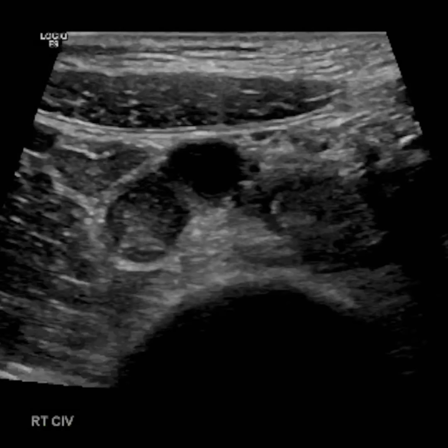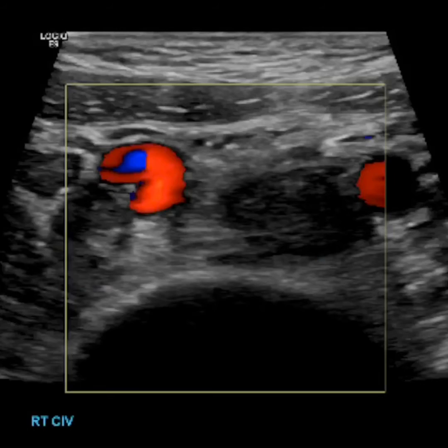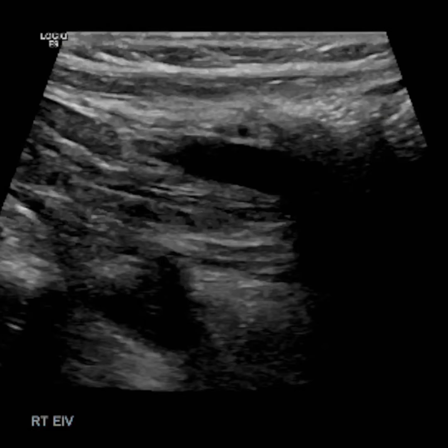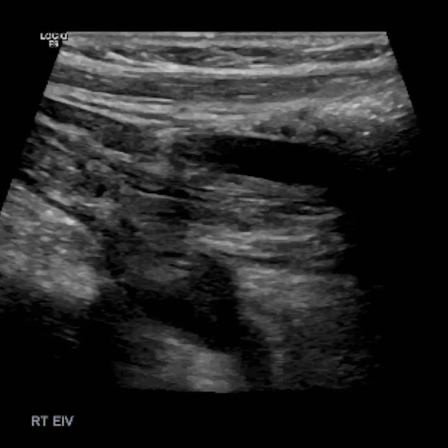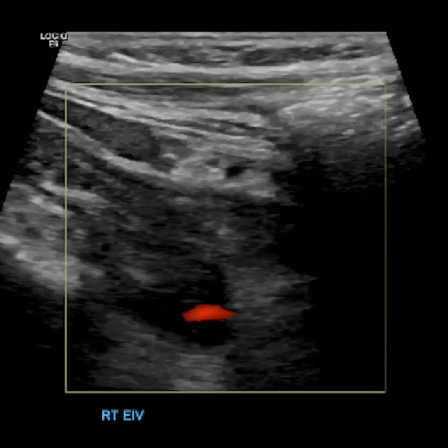This patient had extensive DVT, or deep vein thrombosis, of the common iliac veins — there you can see both common iliac veins and the bifurcation of the IVC. The DVT extended into the internal and external iliac veins. You can see the vessel with echogenic material filling it up, no color Doppler flow, no spectral Doppler flow.